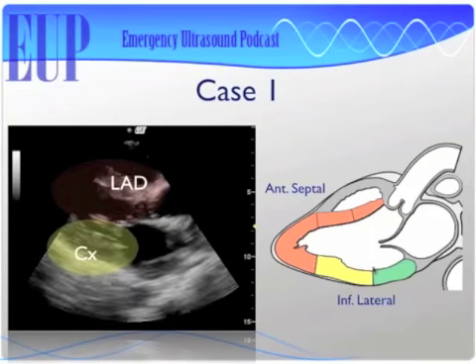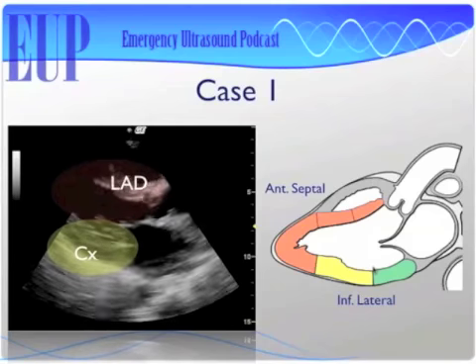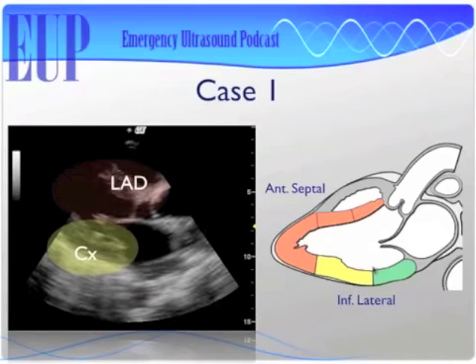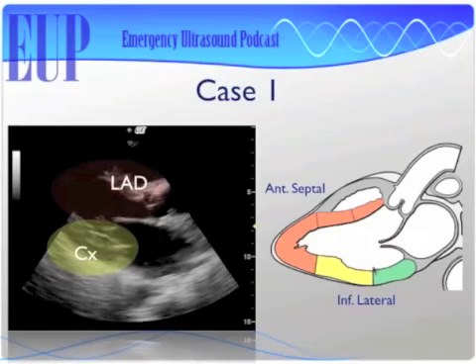So you take that, you compare it with your EKG, you look at your troponin, and you decide, does this patient meet somebody who I would expect to have a circumflex lesion, and decide whether you want to jump on it and get crazy and give them heparin and call your cardiologist, or how you want to handle it.